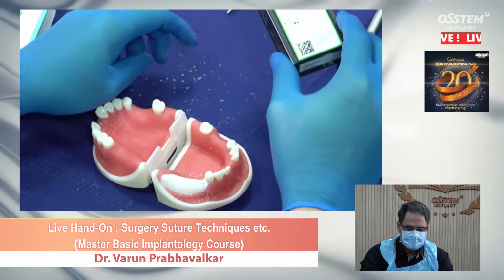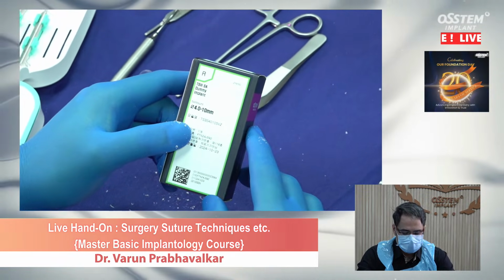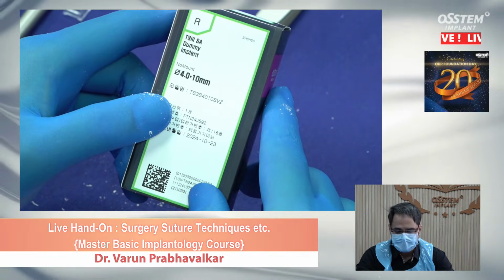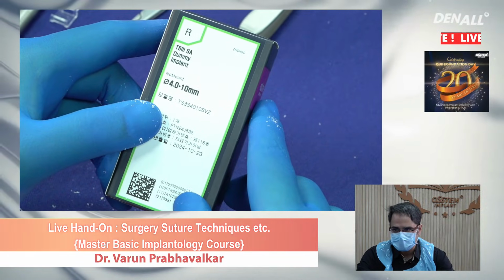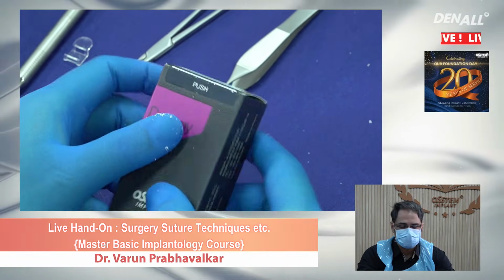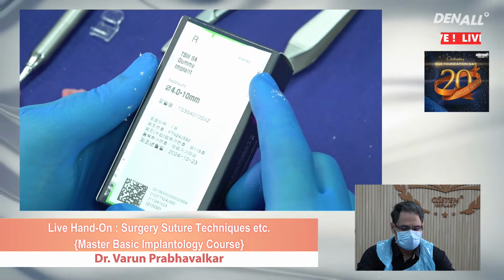Now understand that from the packaging towards the delivery, the implant surface should not be touching anything else except the osteotomy. The packaging is not to be opened by the surgeon, but by the floating assistant, not even your assistant, the floating assistant. Packaging of the Osstem implant is quite simple. What we have over here is a 4.0 no mount implant.